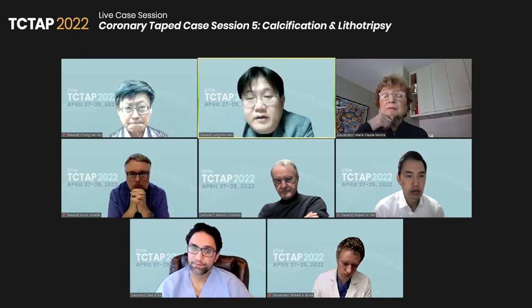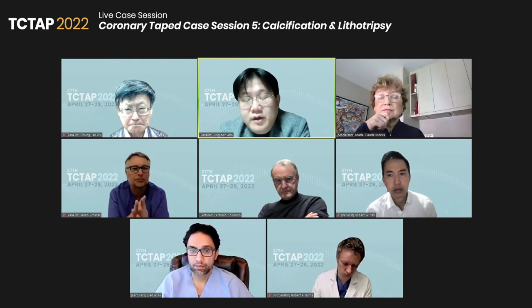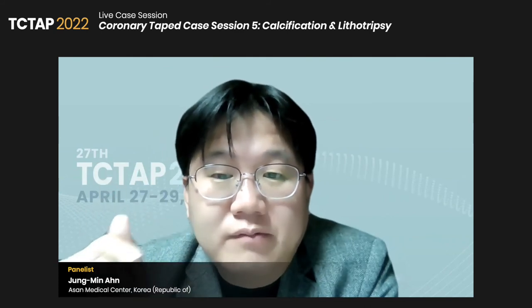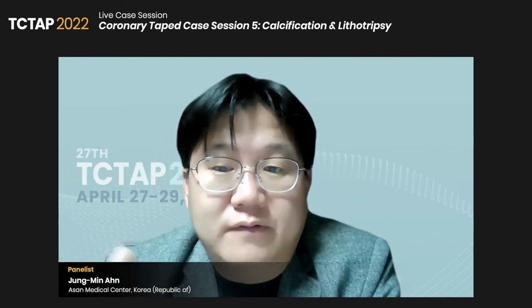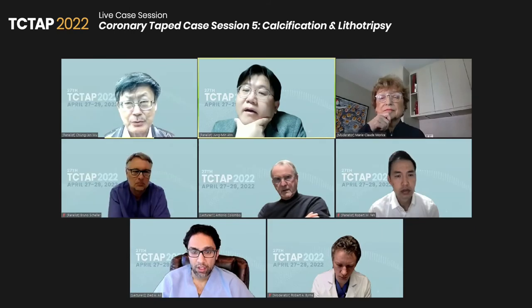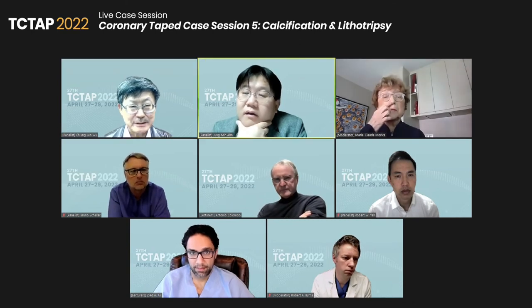Yeah, I think your differentiation, your description is very important. So can you differentiate the three types of calcified nodule in vivo? I mean, by ultrasound or by OCT, can you differentiate the three types? So you have to use OCT compared with IVUS, because IVUS cannot tell these three types.